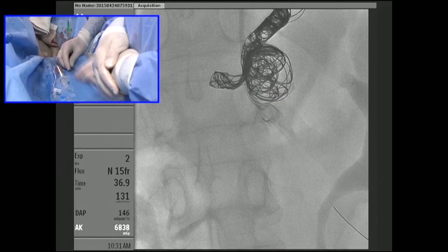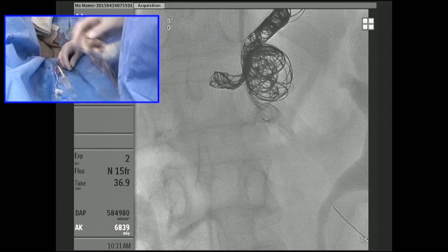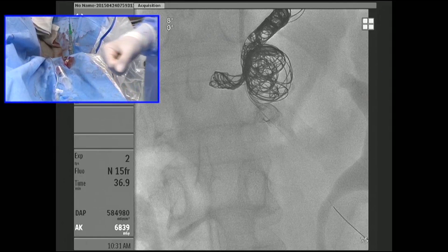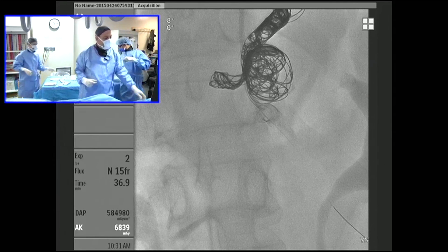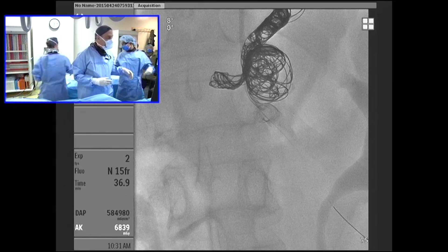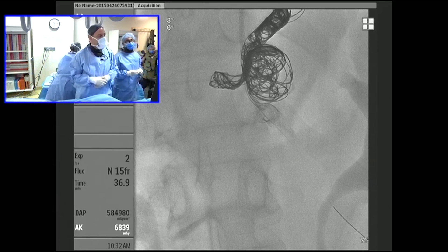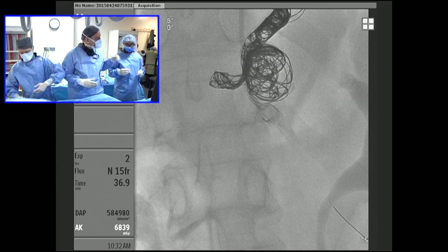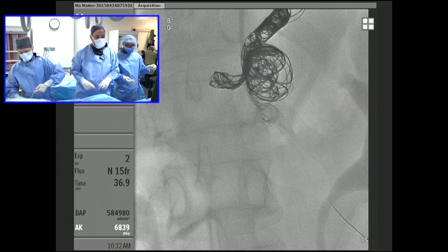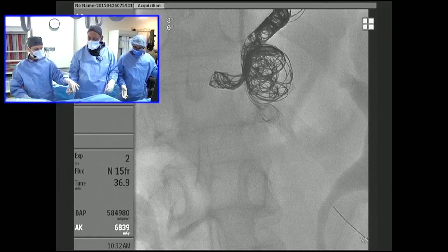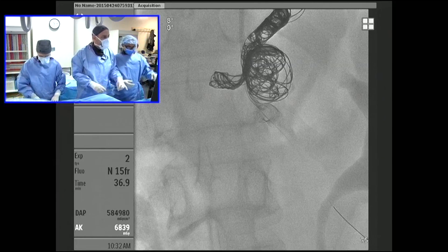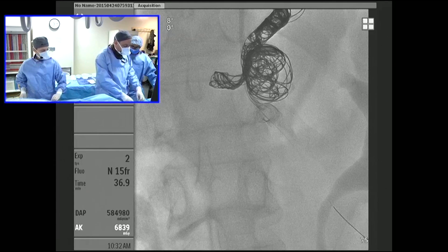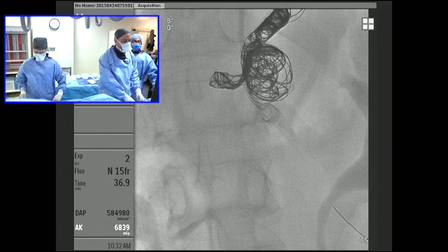This is probably going to take another 15 or 20 coils to really make sure we've stopped all the flow in the aneurysm. This case raises a lot of technical points — not only about stent-assisted coiling but detachable coils, which we really couldn't have done without for this proximal embolization in these branches. As you can see here, it's going to be impossible for this coil mass to prolapse into the superior mesenteric artery, so we have a very safe system.